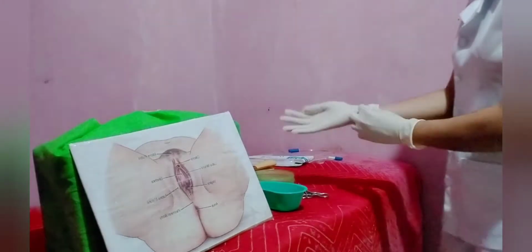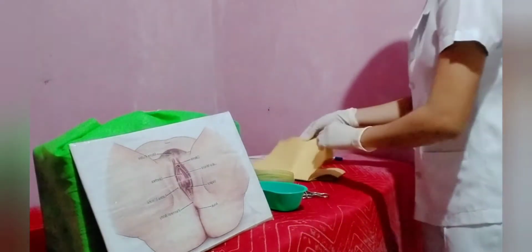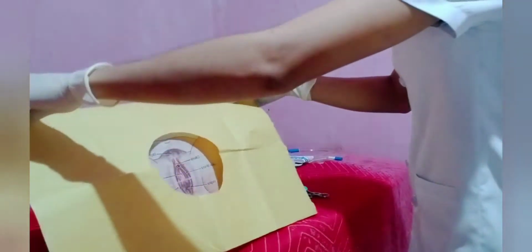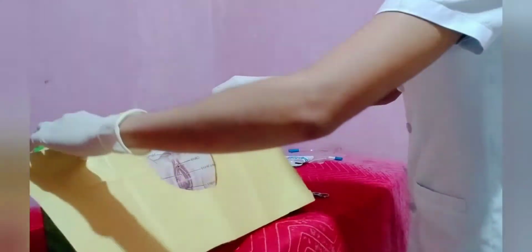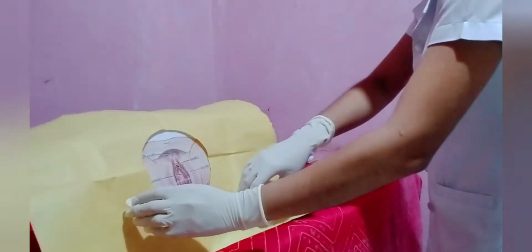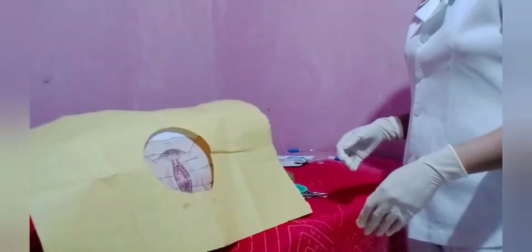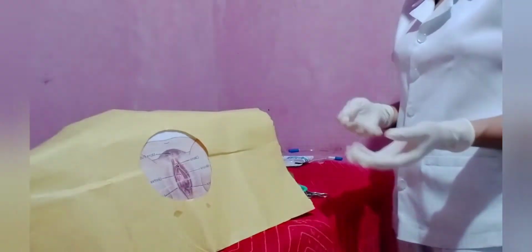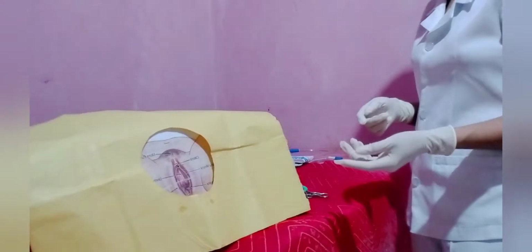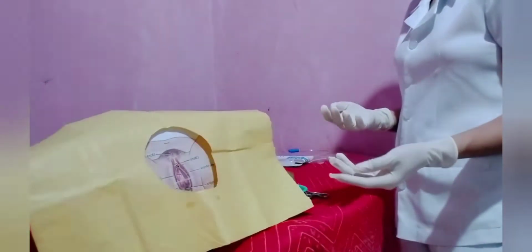And after that, put on the drape and the eye sheet. So I have here the eye sheet. After that, you have to lubricate the catheter for about 1 to 1.5 inches, being careful not to plug the eye of the catheter.